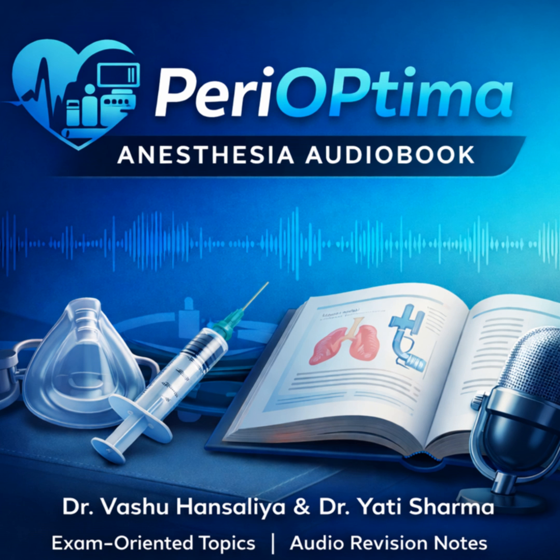I understand this one is pre-shaped, which gives it a bit of a structural advantage. The Supreme is designed for single use, and it's latex-free. Its defining characteristic is that rigid, pre-shaped tube. It's designed with a very pronounced curve to naturally adopt the anatomical contour of the pharynx and hypopharynx. So it just slides into place more easily?